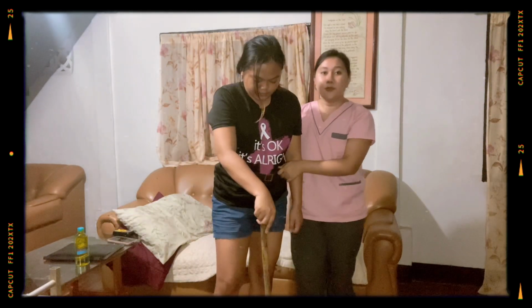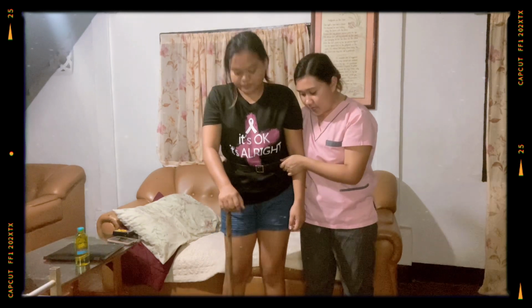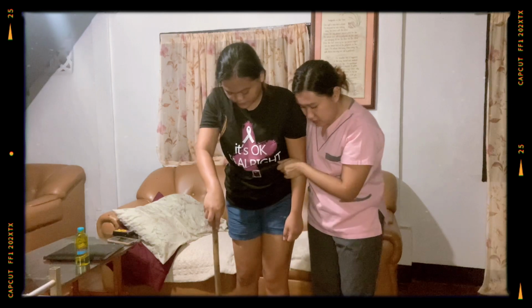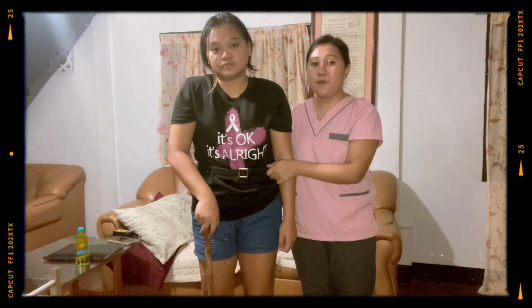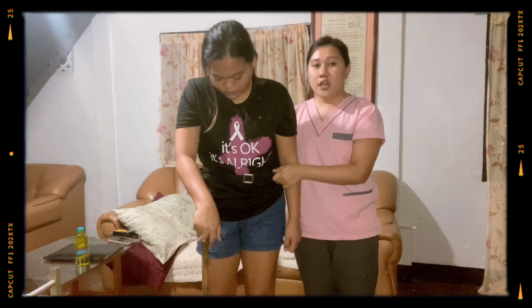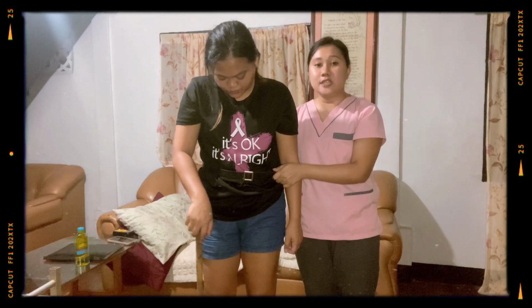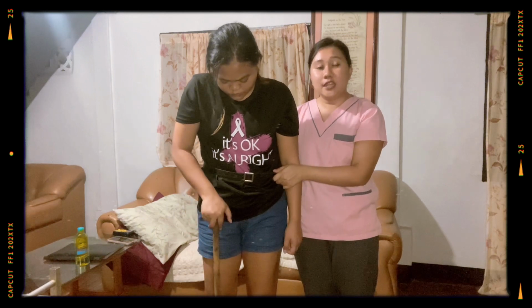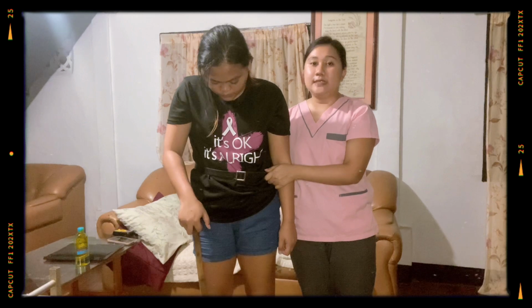So for procedure number 11, continue with ambulation for the planned distance and time. Now we are going to return the patient to the bed or chair based on the patient's tolerance and condition, ensuring the patient's comfort. Make sure the call bell and other necessary items are within easy reach. So this is to let the nurse respond immediately when the patient needs something.